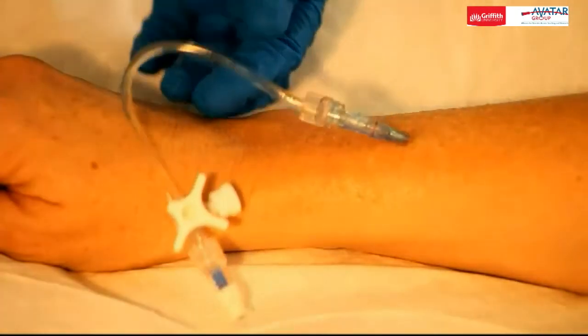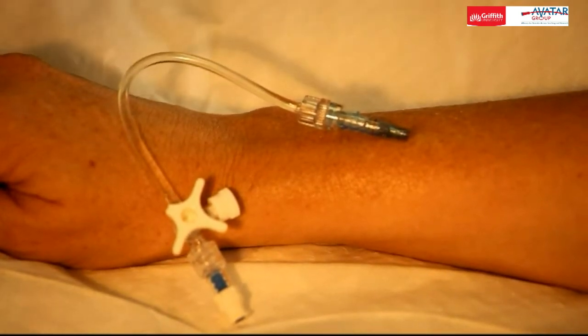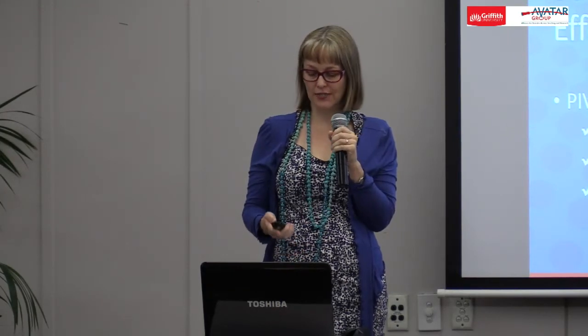So we've now moved on to our next randomised trial. This is what we're working on at the moment. We're looking at this combination securement dressing, the Sorbeview shield. We're doing more work on the tissue adhesive to try and look through that. Now I better get off dressings, even though it's my hobby horse.